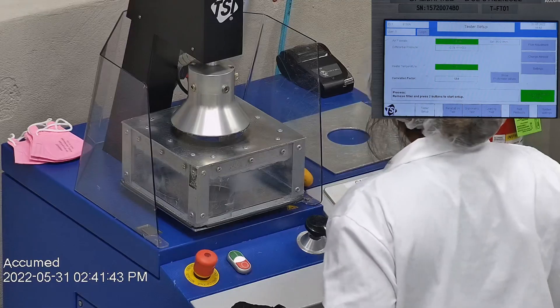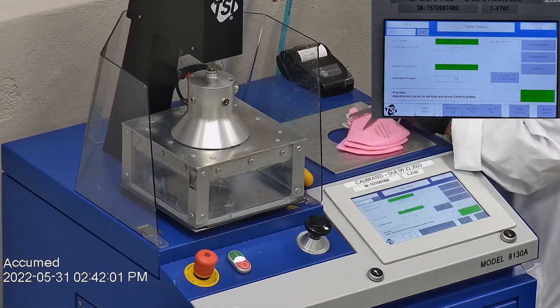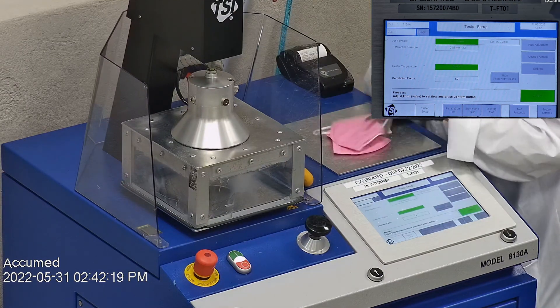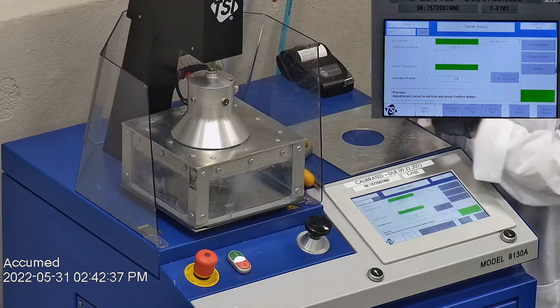Let's go ahead and see how these test on our TSI machine. We're going to be testing both the filtration and the pressure drop. This is our TSI machine model 8130A, which is the same filtration testing machine that NIOSH uses to approve N95 respirators. Our procedure is inspired by NIOSH. We first run a tester setup and start removing the ear loop bands from the mask before placing it onto a testing plate to ensure a proper seal.